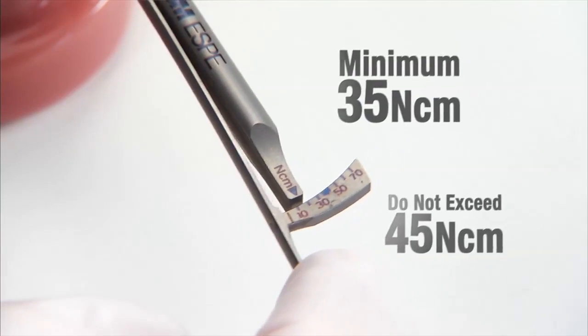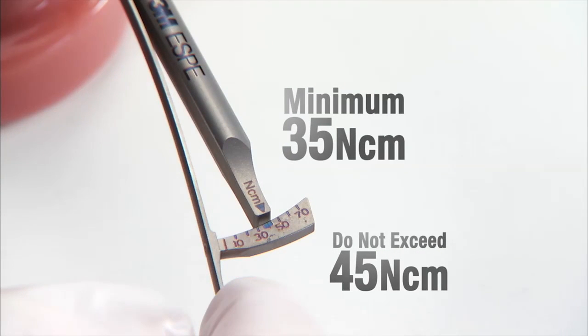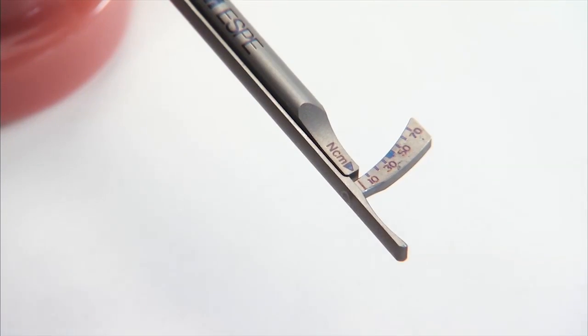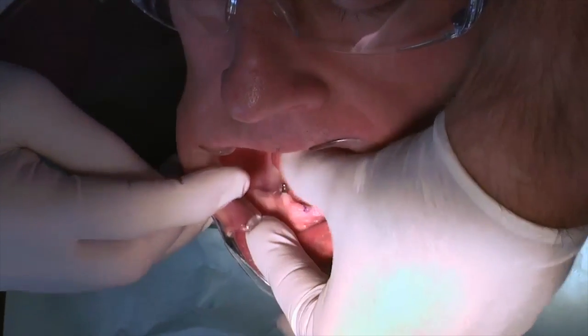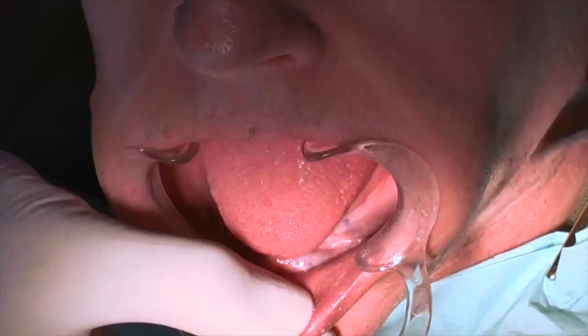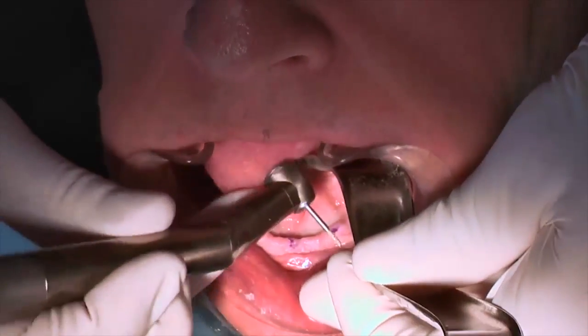For immediate load use of the implant, check for a minimum of 35 newton-centimeters torque. Do not exceed 45 newton-centimeters torque, as this could strip the threads within the bone pilot hole and cause bone damage or potentially deform the implant. The gingival tissue should be directly against the implant neck and sutures should not be required. Verify the implant depth and proceed to the next implant site, repeating the process.